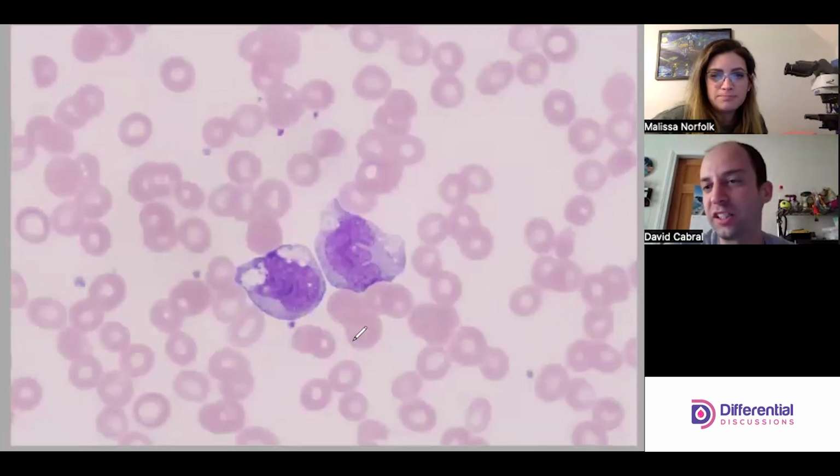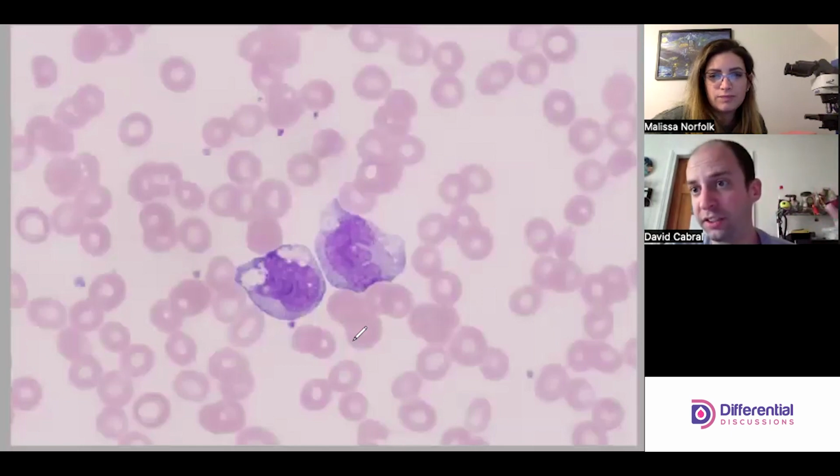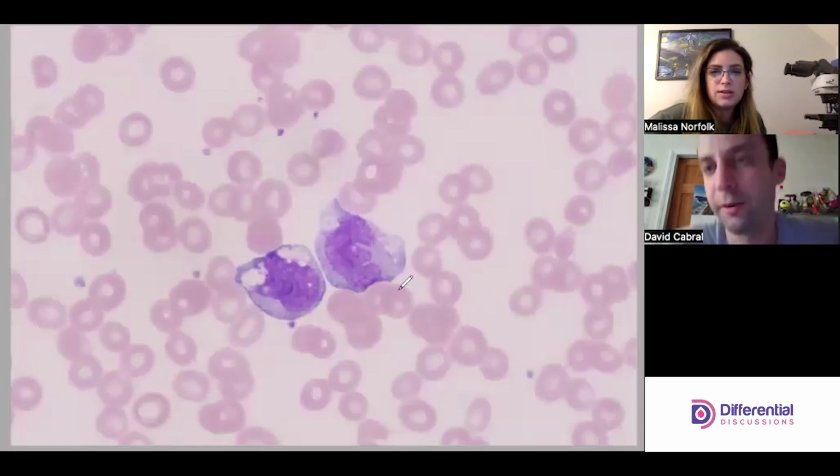Yeah, for me personally, and that might be a little bit careless of me, but I would generally go to mono unless it punches me in the face and tells me. I think they're both monos. Yeah. This one actually looks like the chromatin is a little bit less mature. I see that as well.